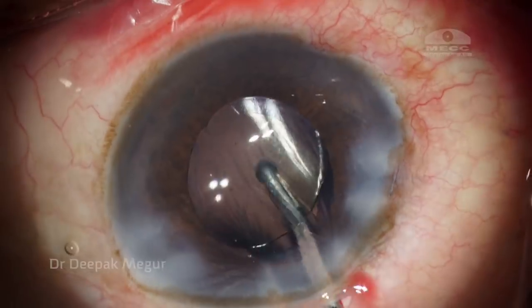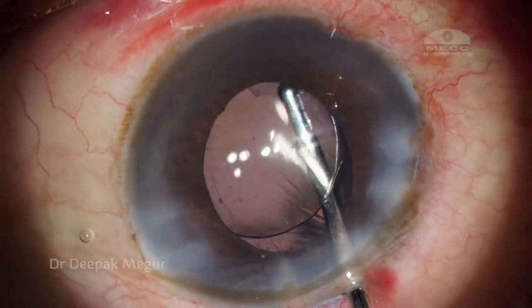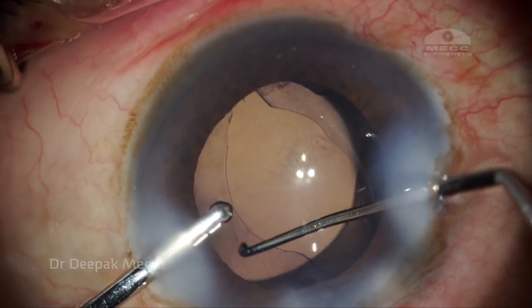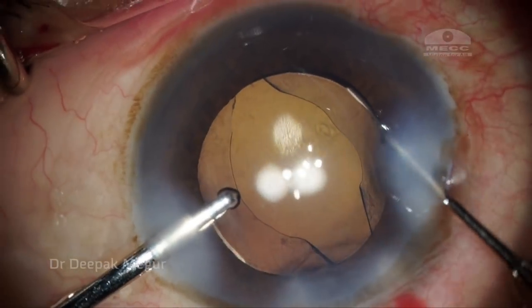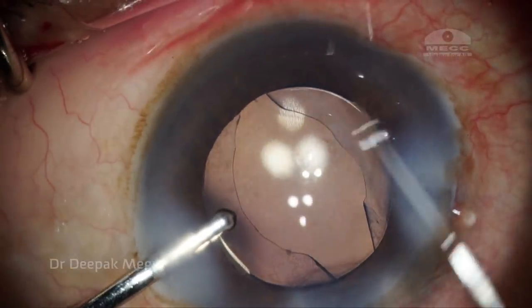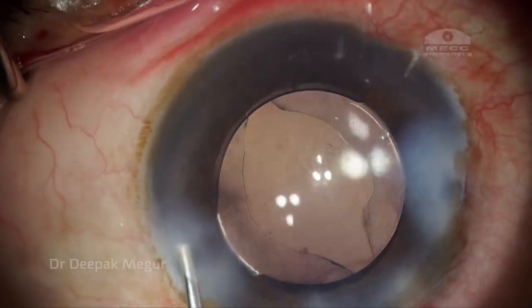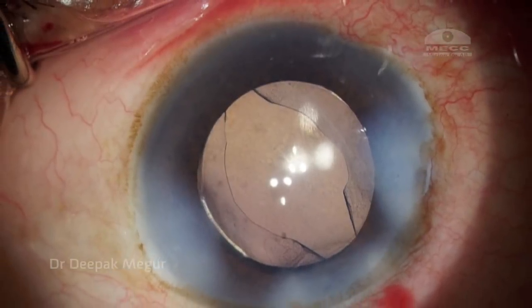I just like to highlight one important point to be noted here, that when we orient the haptics, it's important that the haptics are oriented away from the equatorial tear. Here I'm taking care to ensure that the haptics are at right angle to the meridian in which the equatorial tear has happened. And this orientation is critical because otherwise we may have decentration of the intraocular lens. So again, before removing my irrigating handpiece, I'm trying to hydrate my wounds so that we don't have any shallowing of the chamber. And then we just close the wounds by hydrating and that's it. The case is done.